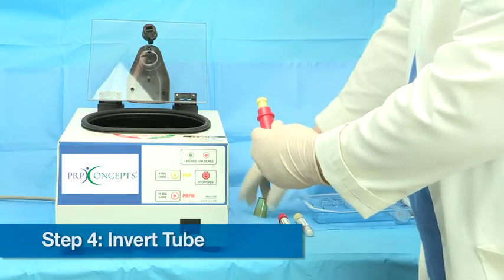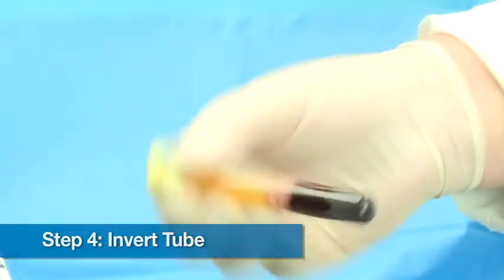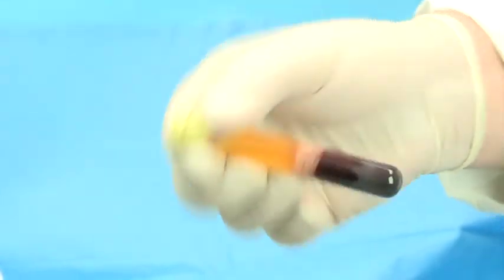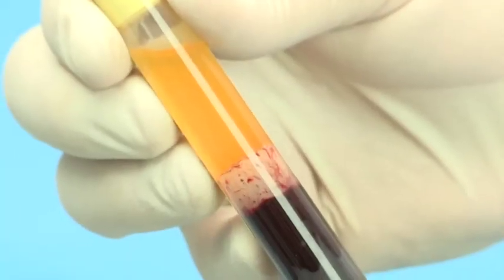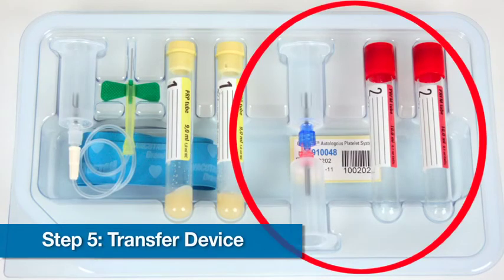Remove yellow tubes from tube holders. Gently invert yellow PRP tubes 7 times to resuspend platelets. Plasma should appear turbid, indicating resuspension of platelets. Remove transfer device and red Prfm tubes from tray.